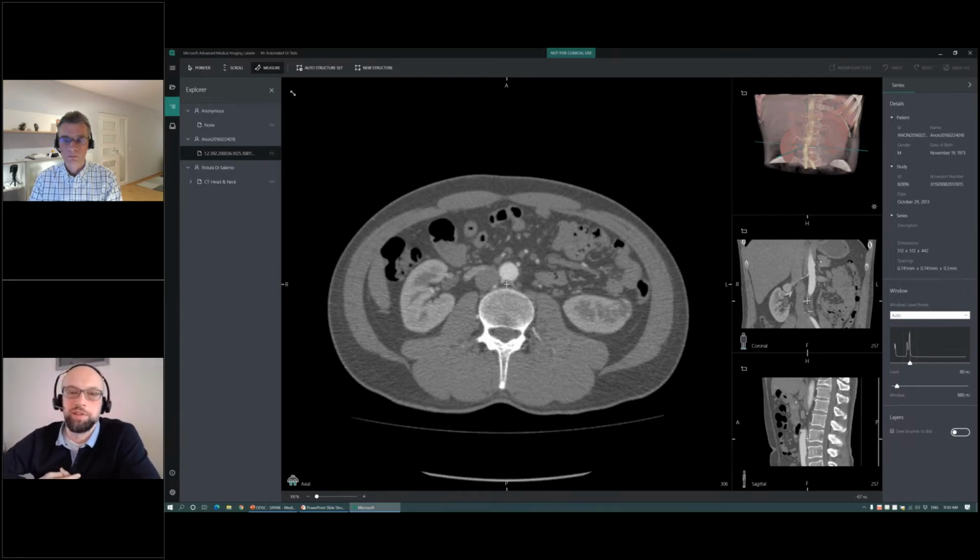So in medical images, segmentation can be delineating the boundaries of the organs. Segmentation comes up in many subspecialties of medicine, but the one that drew our attention many years ago within Project InnerEye and motivated this tool is what's called radiation oncology.